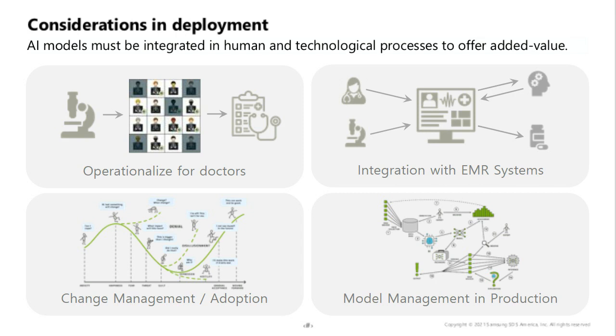Lastly, there is a big challenge of change management and adoption, where we, the AI community, have to work hard at motivating end users such as physicians or hospital management or in fact the patients themselves into utilizing these AI methodologies and trusting them to get it right, which has a lot to do with the explainability concept that was mentioned earlier. If you put a whole slide image into the AI system and out pops the diagnosis that you have cancer, your first question is likely to be for an explanation of why that is the case. And so these AI methodologies must come up with a human understandable reason as well. And that will largely help with the change management process of getting people to trust these systems.